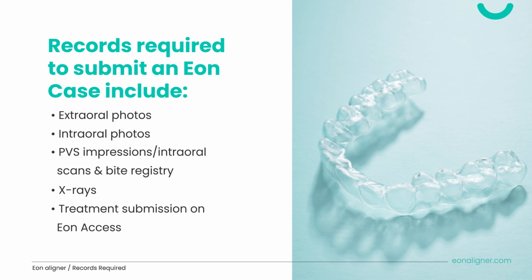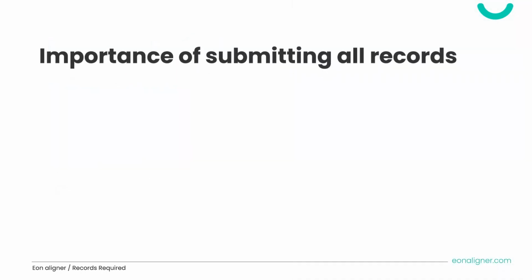Although only impressions and scans are mandatory to complete the case submission, while other records will be set as optional, it is advisable to have all the aforementioned records submitted for proper diagnosis and treatment planning. So what is the importance of submitting all records? It's important to give Eon's treatment planning team a comprehensive and full picture of the case to be able to provide the best treatment plan.